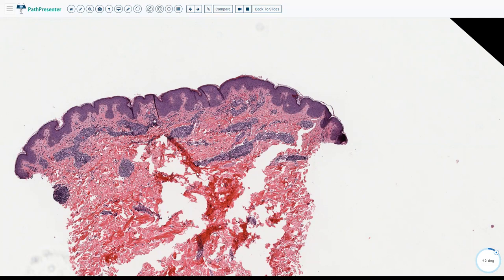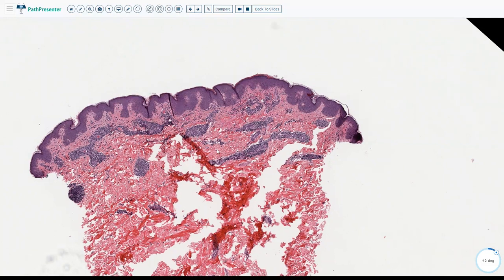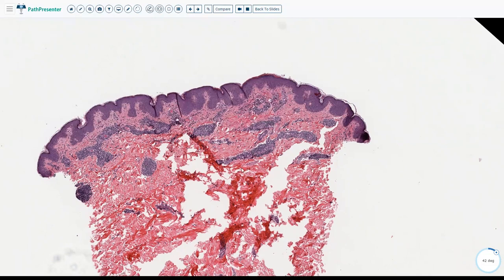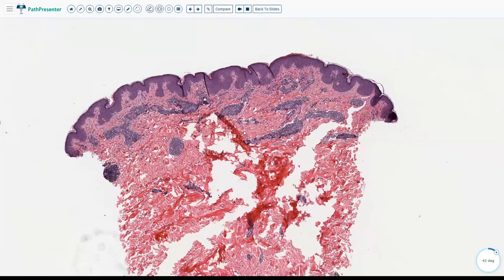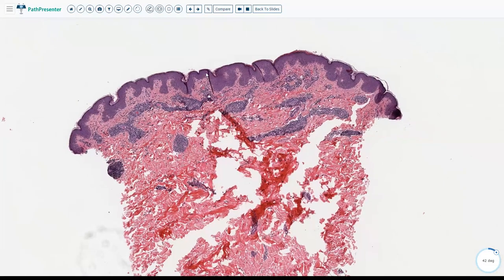Histologically, two EAC patterns have been described: a superficial EAC and a superficial-and-deep EAC. The superficial type may show some spongiosis in the epidermis, while the superficial-and-deep type shows inflammation going quite deep with very little spongiosis. The key feature to look for in both is the tight coat-sleeve pattern of lymphocytes around the blood vessels.